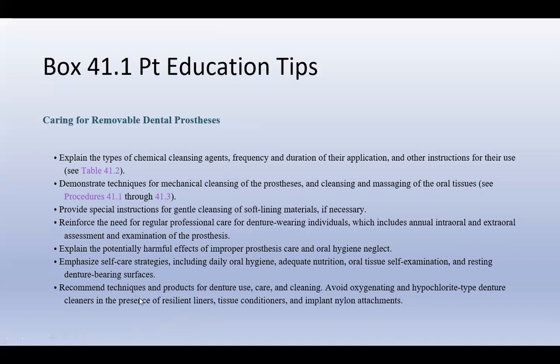Recommend techniques and products for denture use, care, and cleansing. Avoid oxygenating and hypochlorite-type denture cleaners in the presence of a liner. Those just tend to be a little bit too harsh, and they could wash away or damage the reline.